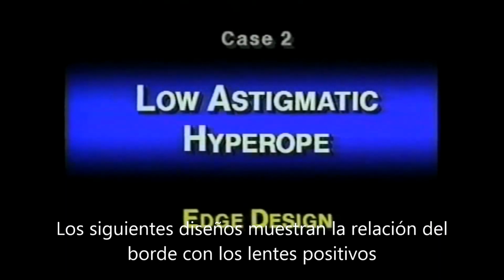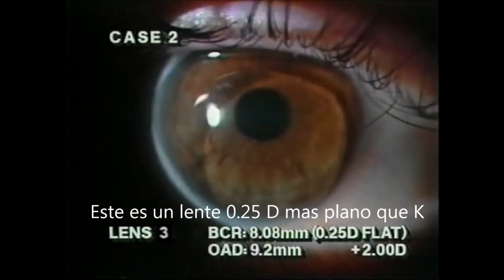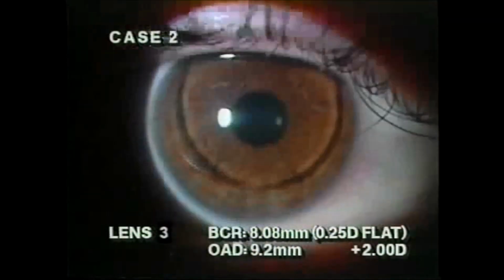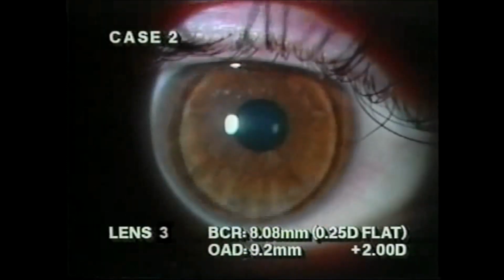The following lenses show how a minus lenticular edge design can affect the fitting relationship of a plus power rigid lens. This lens is fit a quarter of a diopter flat on a low astigmatic hyperope. After the blink, it quickly decenters inferiorly. In part, this poor fitting relationship may be attributed to the large mass characteristics of a plus power RGP.